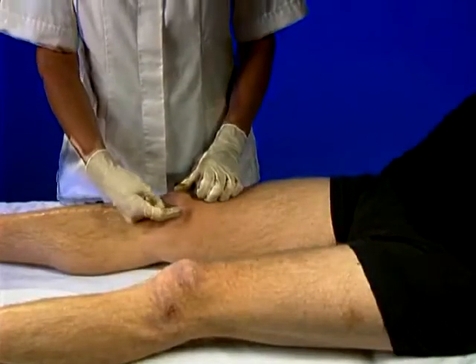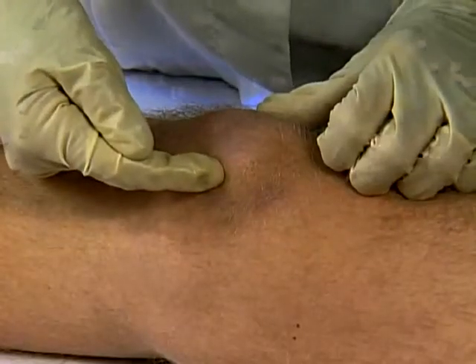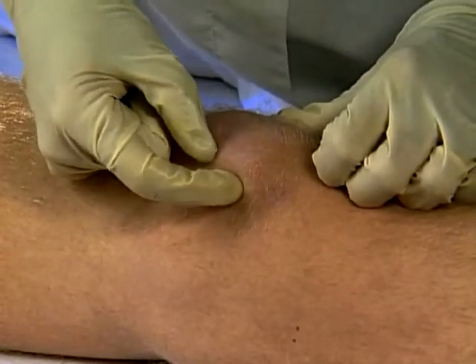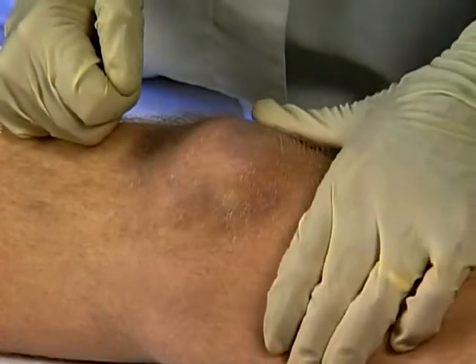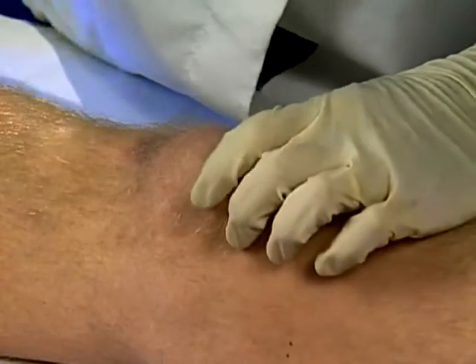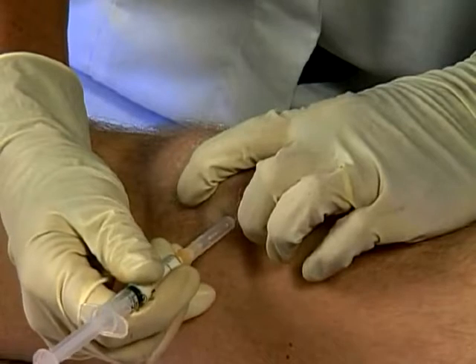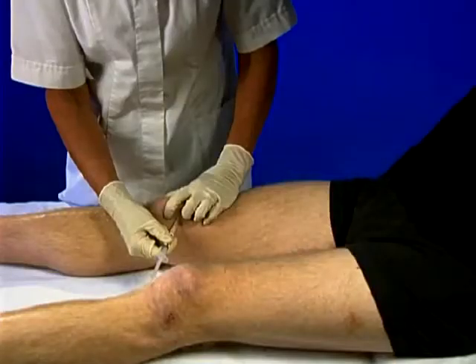The expansion is usually strained on the medial side at the superior pole of the patella. Push patella medially and hold it in place. Palpation identifies the extent of the tender area. Mark entry point here. Clean and firmly stretch the skin and rapidly insert needle perpendicularly. Pepper along the edge of the patella, avoiding entering the knee joint.